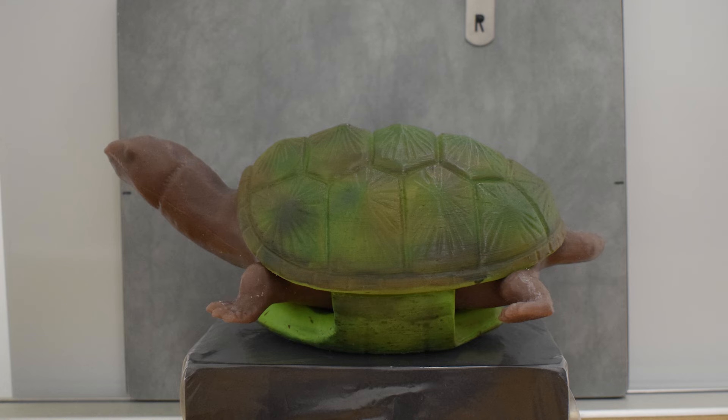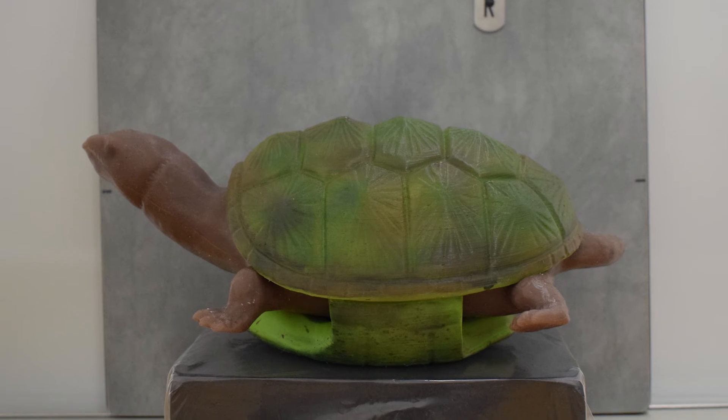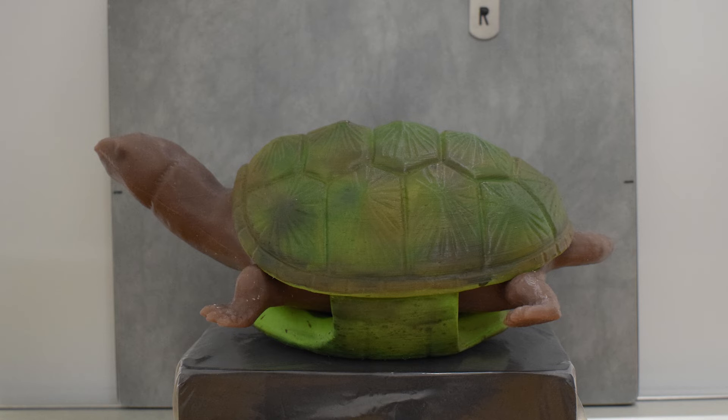For the following two projections, the turtle is jacked up by a block of foam or something similar that is covered with a bag or shoe cover. The use of an adjustable x-ray tube is important for the lateral-lateral and cranial-caudal exposure, as the beam path can be guided horizontally through the animal. The turtle's organs move within the coelomic cavity and would be displaced if the animal was rotated. Therefore, lateral-lateral and cranial-caudal imaging only make sense if the turtle is in a physiological position.